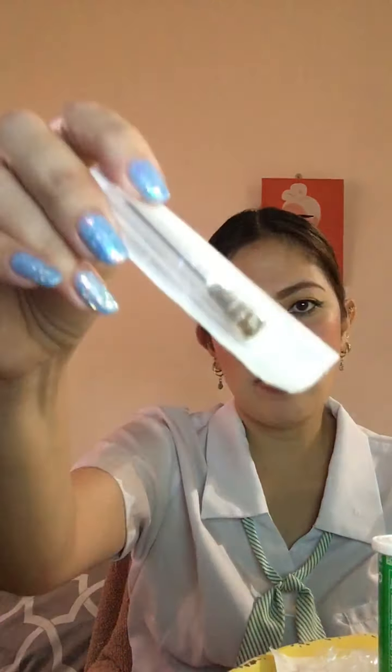Needles are made of stainless steel, and most are disposable. So this one. Now needles have three parts, which are the hub that fits onto the syringe, the cannula or the shaft, and the bevel. Now, how do we prevent needle stick injuries?